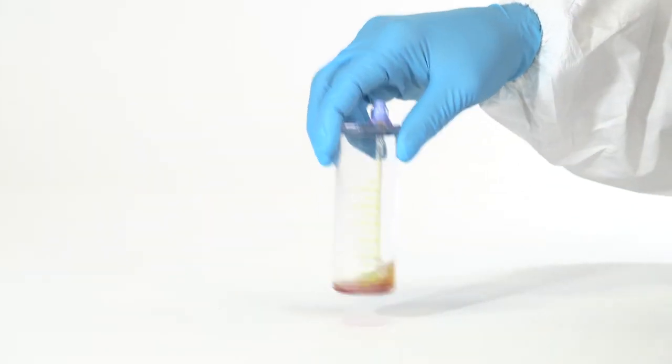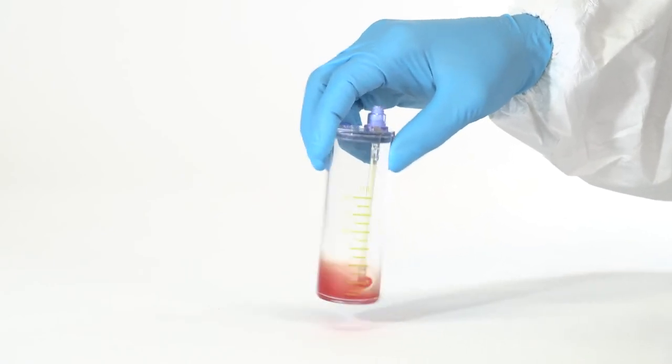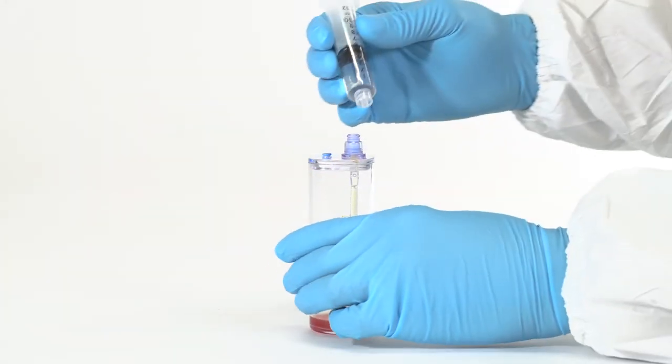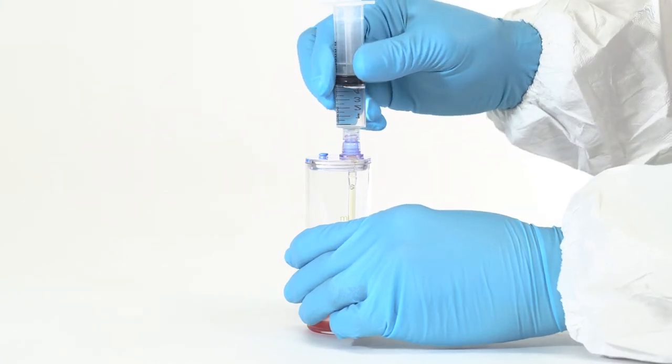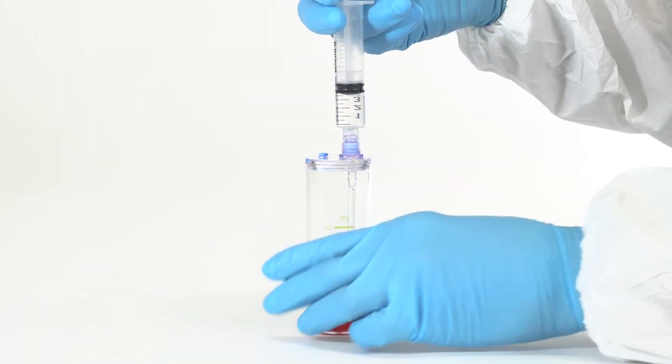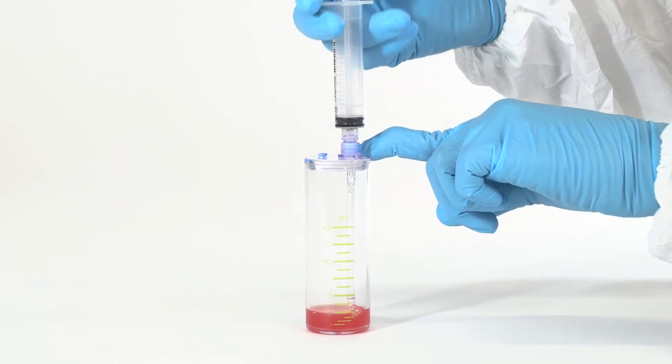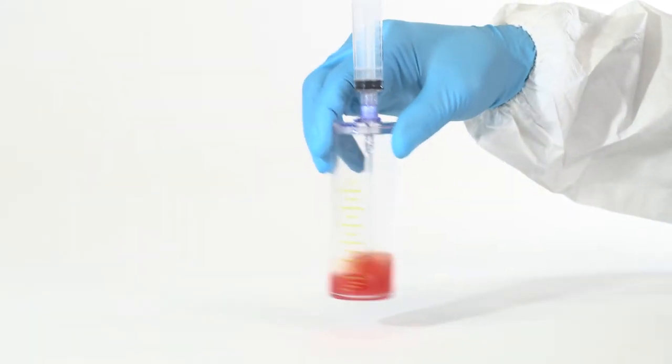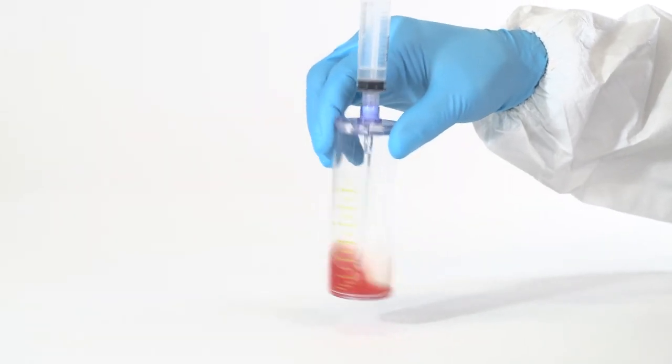Vigorously re-suspend the platelets into the plasma. Then add approximately 5 milliliters of normal saline to the accessory device. Re-suspend the saline into the solution creating 7 milliliters of no-burn PRP.